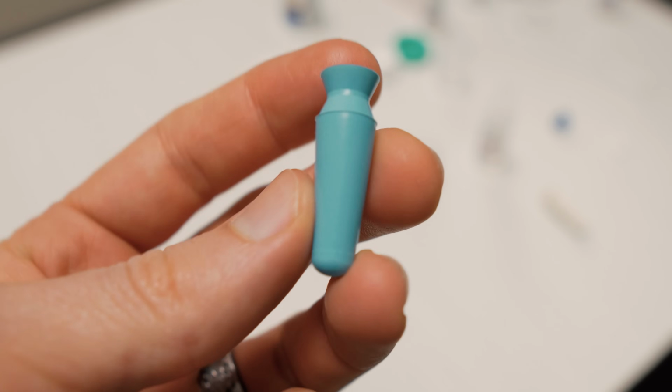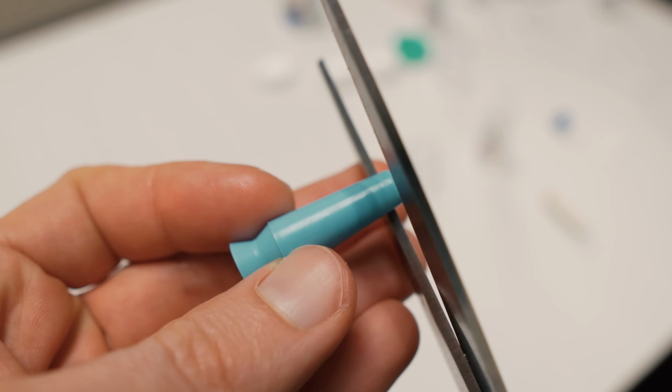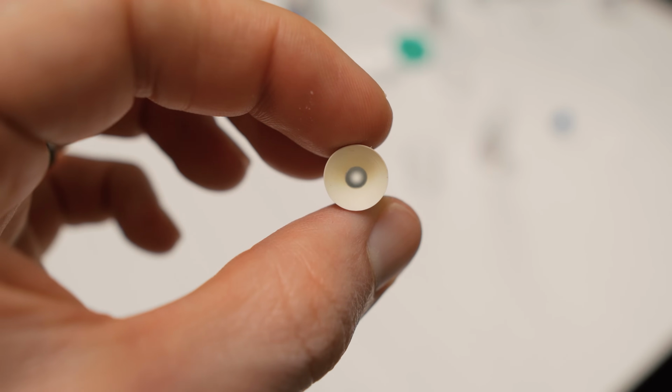Now, there's a few different ways to insert scleral lenses. However, I prefer to use a little plunger called a DMV. Now, a pro tip is if you get a DMV and it does have the bottom being rounded, you can go ahead and use the scissors to snip that off, because afterward you'll have a DMV that has a little hole in the bottom, and with this little hole you can see a light passing through it, and it acts as a guide for you when you're putting in the lens.